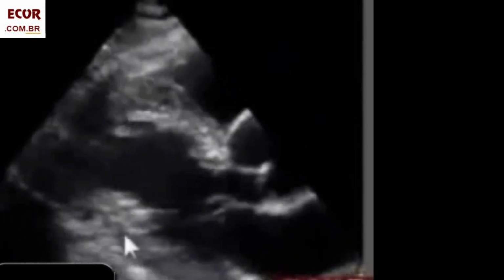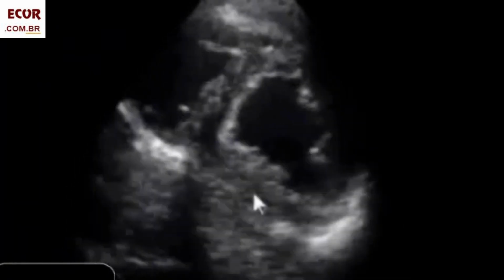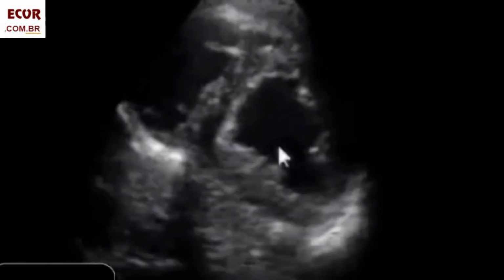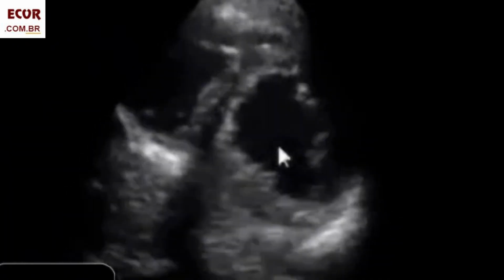Once again, what happens is that during diastole, we're here, and during systole, the heart moves apically, and we're not here in a short axis, and hence more distant from the transducer, with an aspect suggestive of dyskinesia. It is interesting that in these patients, if we perform 2D speckle tracking, it will be normal in these walls, showing that it's really not a dyskinesia. But the study of speckle tracking will be in other lectures.